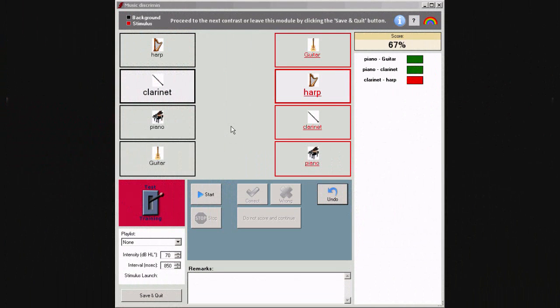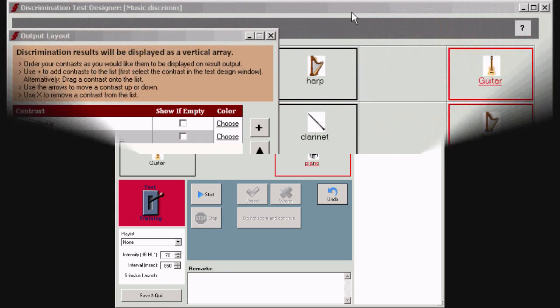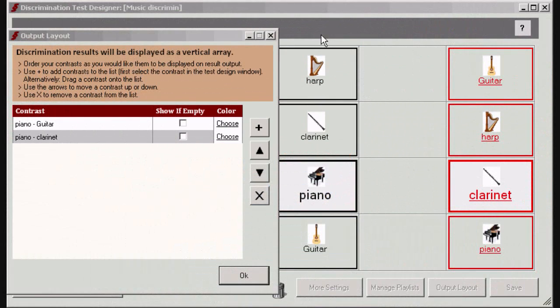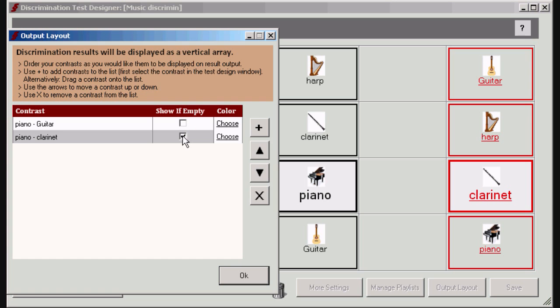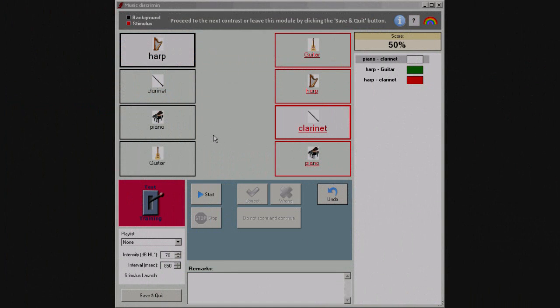The actual setting would have the following consequence. Suppose that the contrasts piano guitar and piano clarinet are presented during the test, together with a number of other contrasts. Then the results of the piano guitar will be displayed first. The contrast piano clarinet second. And any other contrasts will be displayed in the order of presentation. Check this box if you want to display the contrast on the results report, even if it has not been tested.